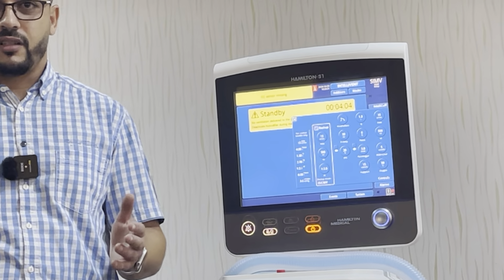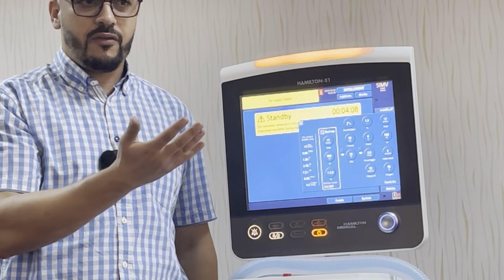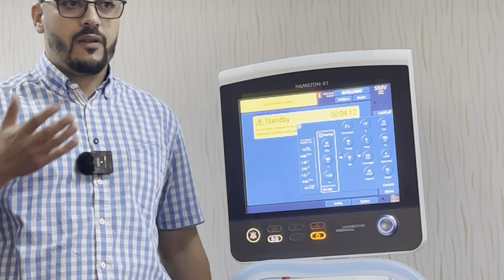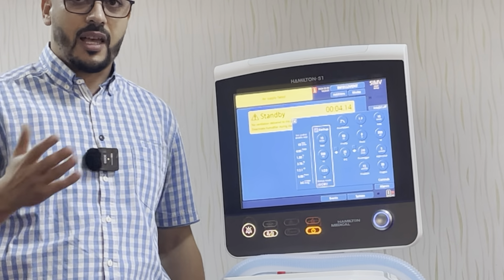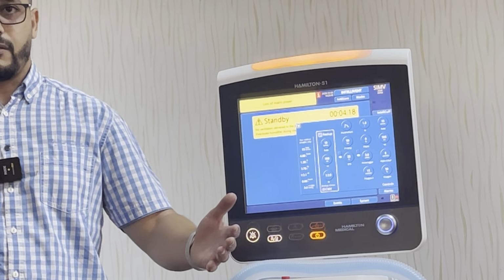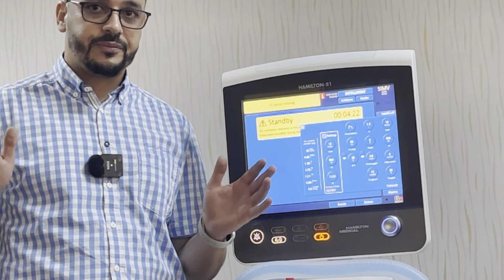يعني if the patient صحيح تخصم الماشين، لو البيشنت has taken 5 breaths spontaneously الماشين will deliver only 10. If the patient does not take any breath machine will deliver 15. If the patient took all the 15 spontaneously الماشين will not deliver anything.